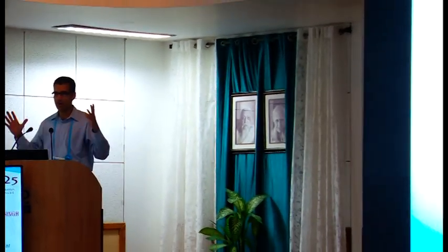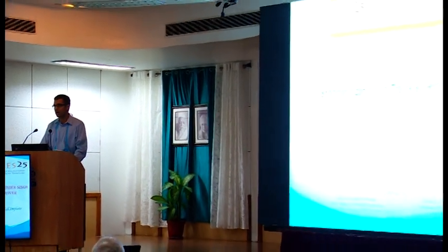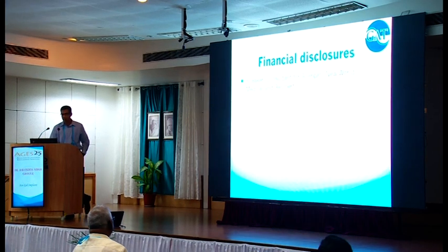The site, yeah, we usually have a panel so you can go a little mid-peripheral and not necessarily right at the edge. And there are a number of papers who say you can do it anywhere in the 360 degrees, but I have seen enough patients refer to me that if it is done in the mid-peripheral region, that is in the interpalpebral aperture area, please be very, very careful. If you have even one patient like that, they'll keep saying, oh, what you did, I was completely normal. You have put something over.